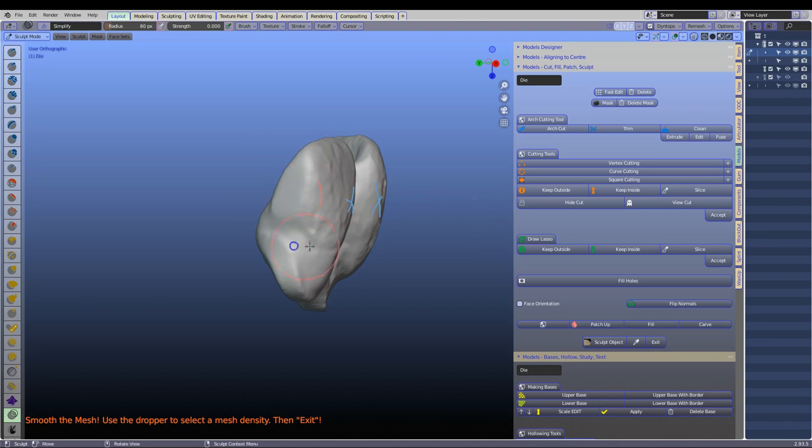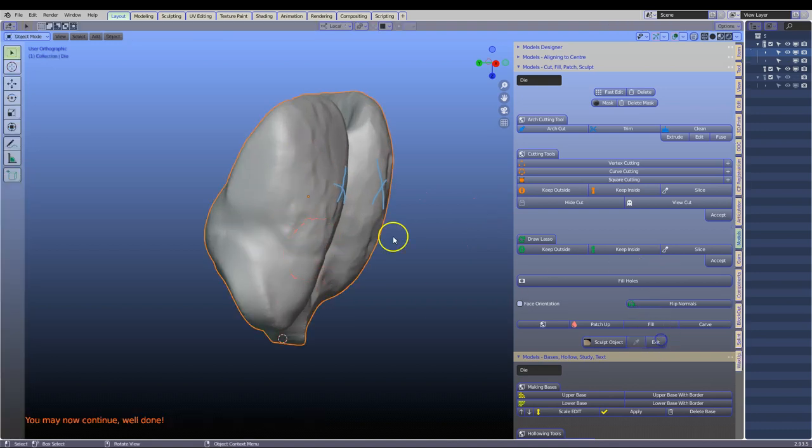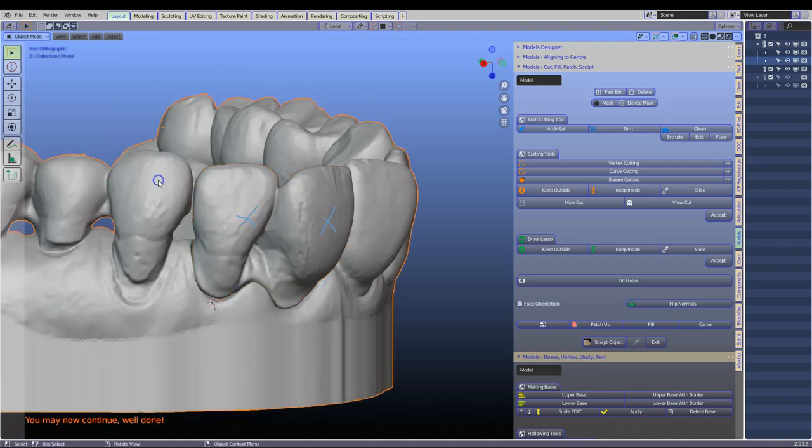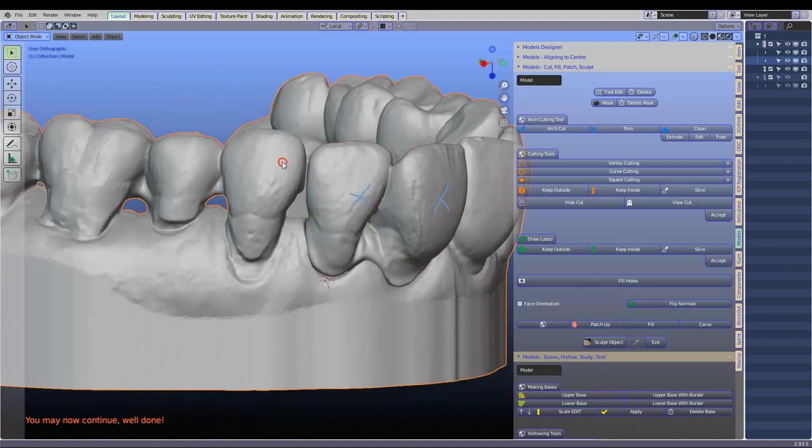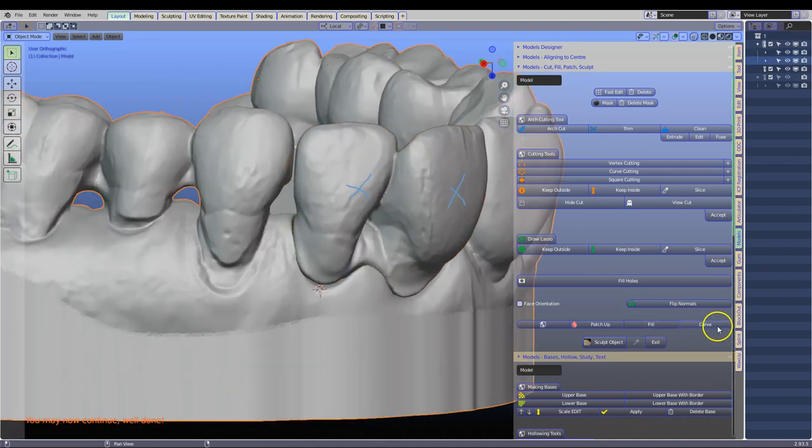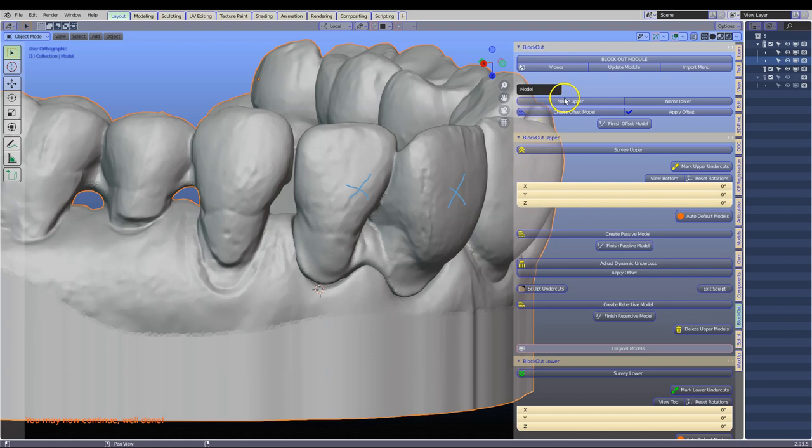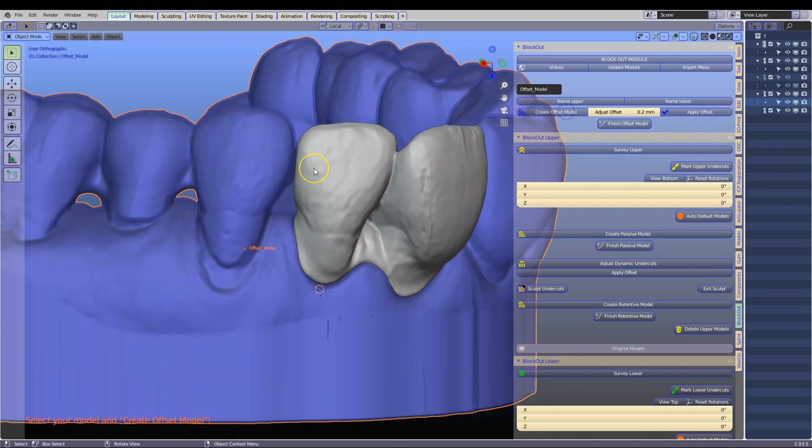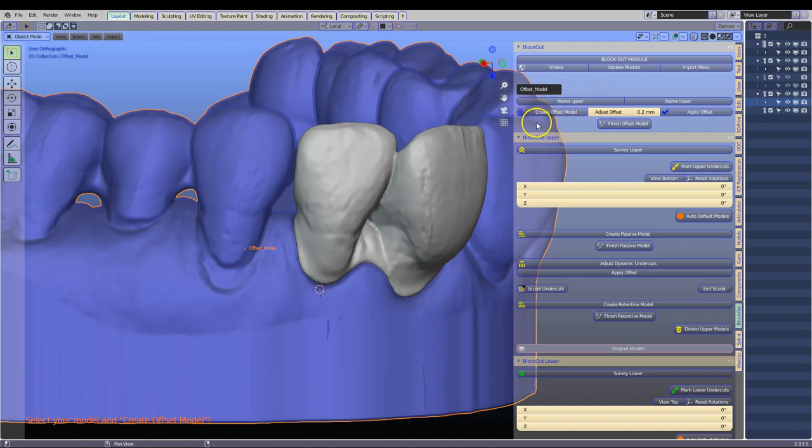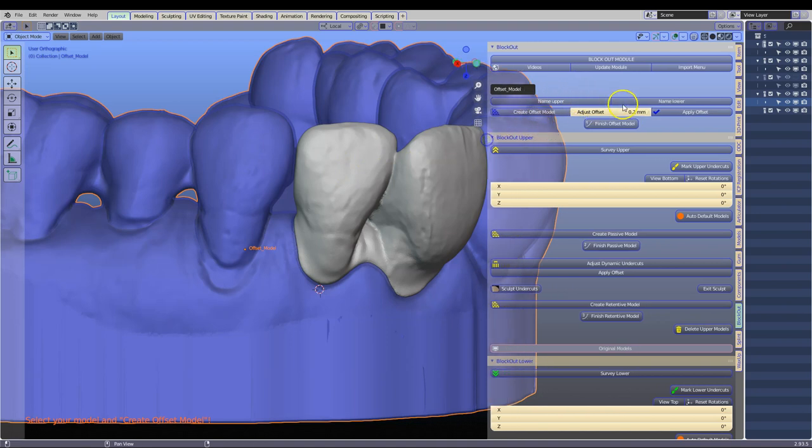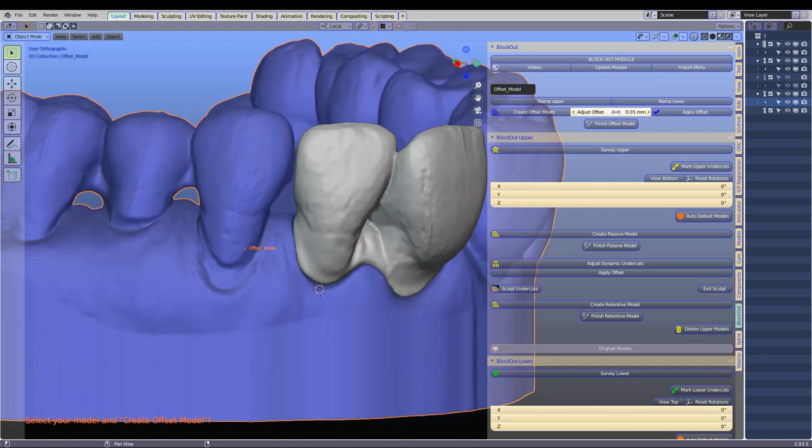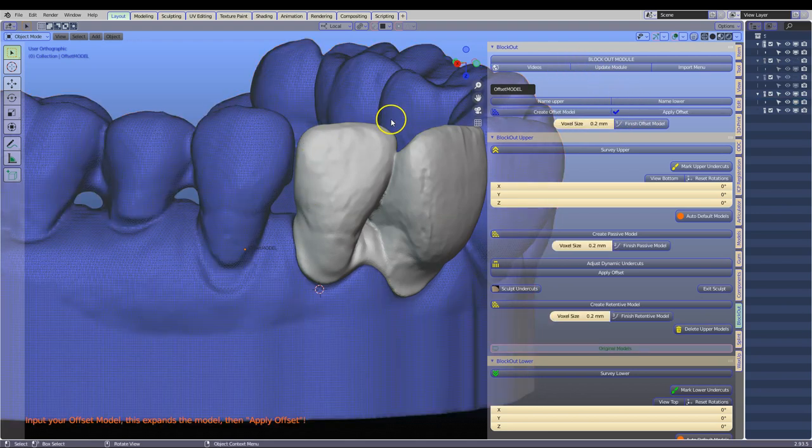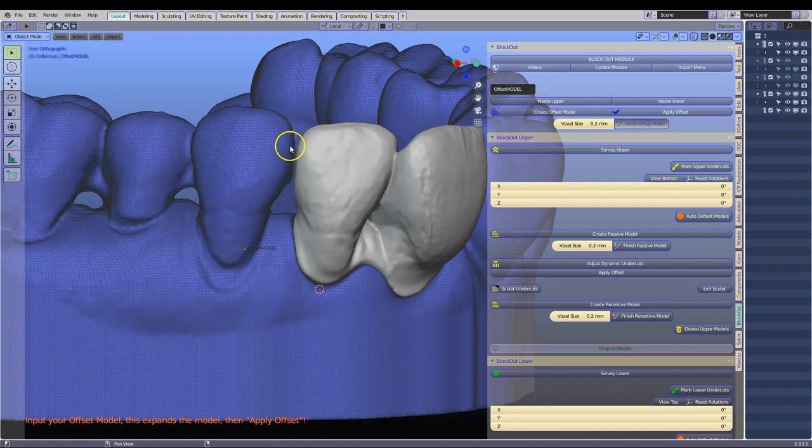Next thing what we are going to do is we are going to exit. Alt H to unhide. Select your model. Go to the block out. Name this upper and create the offset. Now if you are printing then we need a larger offset. If you are milling this like in zirconia it will be a smaller offset. So here just assuming we are milling this out. Just put it at 50 microns like that and apply that. So if you are doing the resin keep it bigger. This is important because this is the engineering offset that we need.